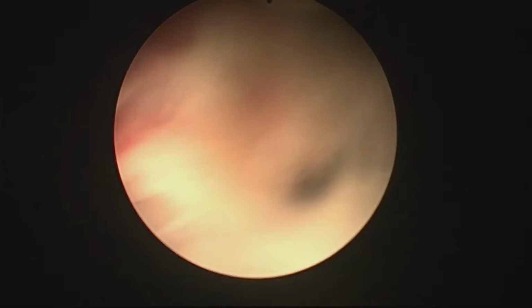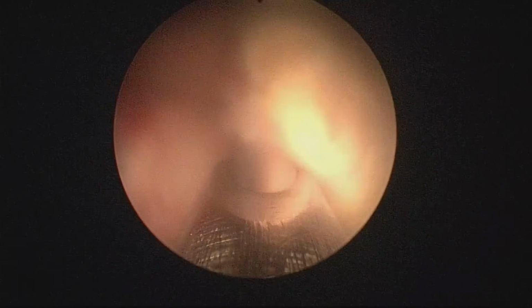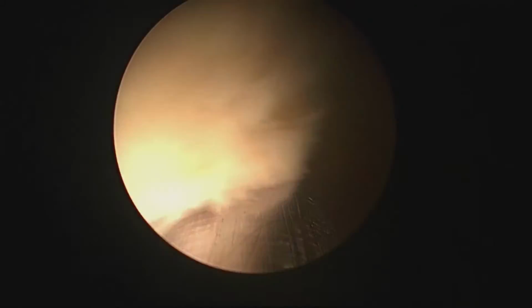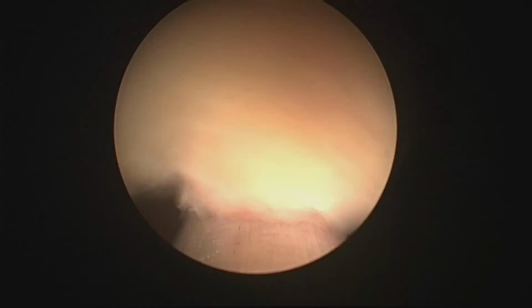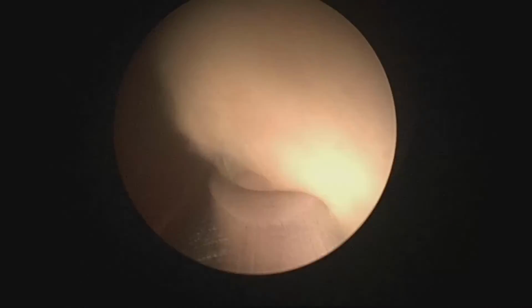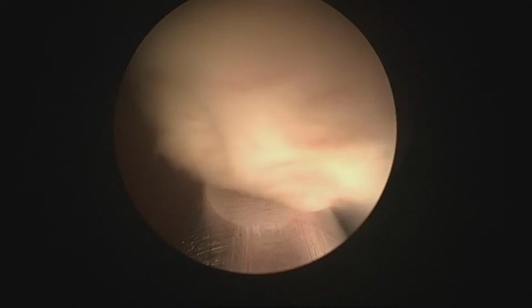Often this post-TURP tissue is also very fibrous and sometimes difficult to morcellate. There's a lot of fibrosis. It's tissue with the consistence of leather, very, very difficult to cut. But in this case, it was not so bad. It just took a little bit of time to morcellate. Just have to be careful to keep the bladder full and to keep the blade away from the bladder wall.